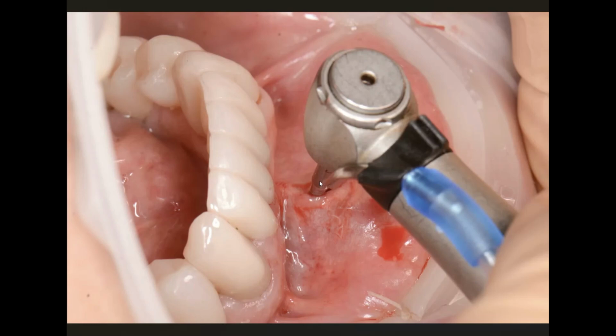It can't really be 90 degrees because it's going to be in the way of the teeth. You don't want it flat out too far. You want this upright, about as upright as you can. So it's close. Why? So the scan body is close to the teeth and you're going to get better accuracy when your intraoral scanner has a shorter distance, a shorter path to scan.